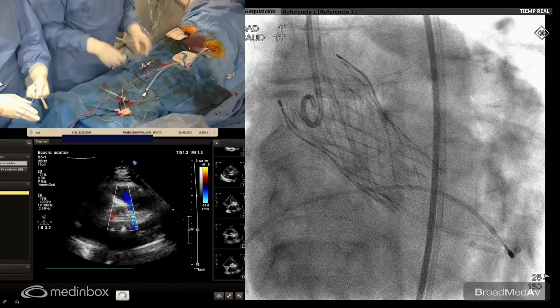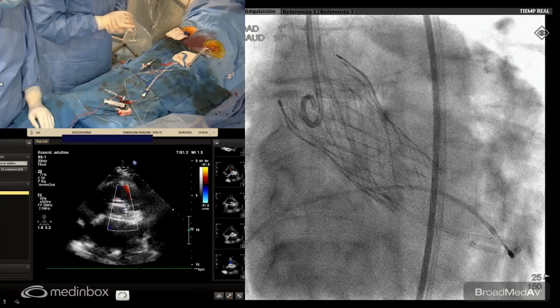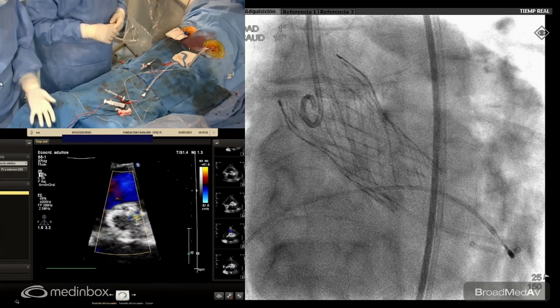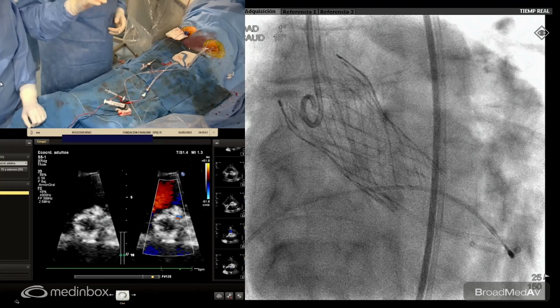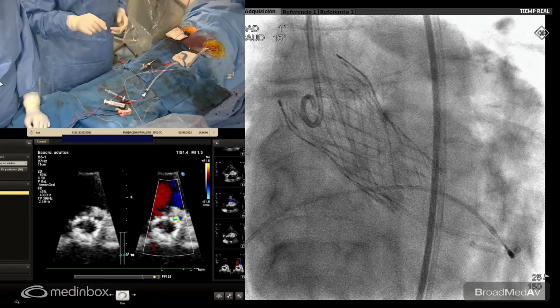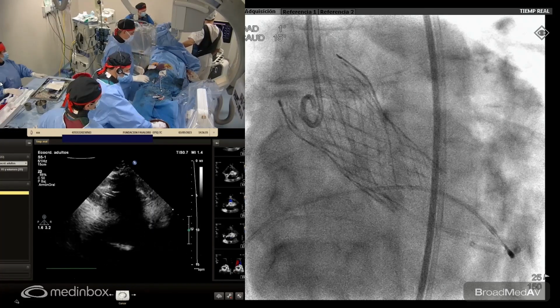The valve with no gradients. And I think the paravalvular leak is not significant. And we still need some time to leave the valve opening a little bit more. Now, as Dr. Mukarcel said, the valve is more circular. And we don't have the leak between 12 and 3 o'clock that was observed, just a very small leak there. This is shown there at 2 o'clock. Yeah, we have two small leaks. The main one is the one that you just said at 2 o'clock.